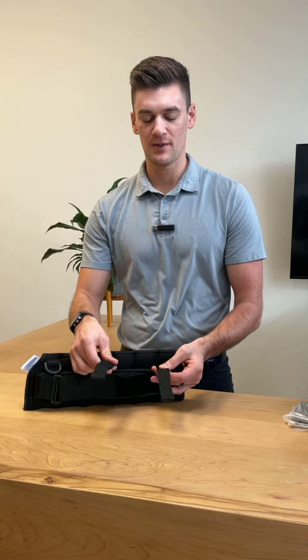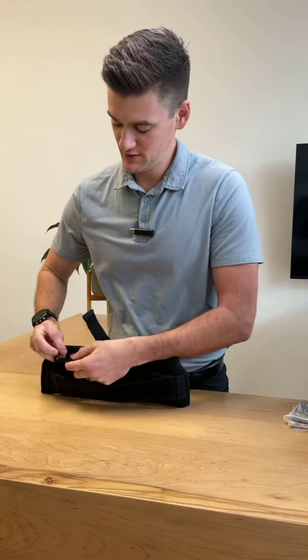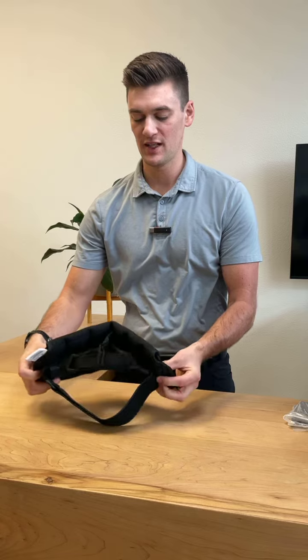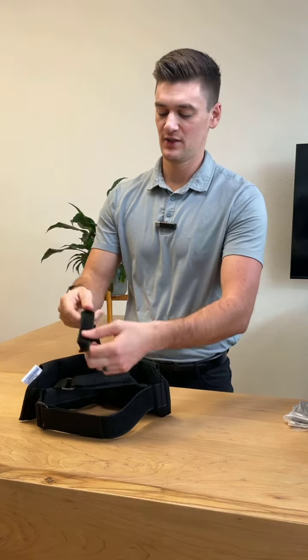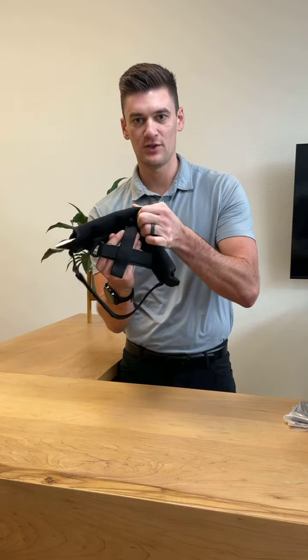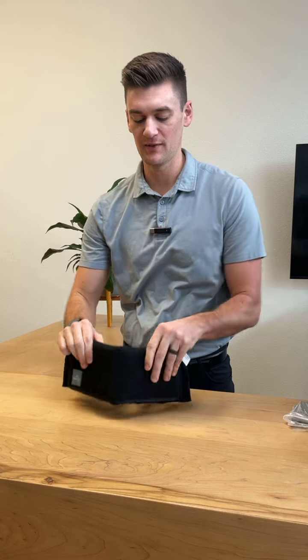The next step that I get the most questions on: we have these two velcro straps. The one on the side you want to undo, and you're going to bring it straight across to this plastic d-ring, then pull it through and back down onto itself. That helps create the top bridge so the head weight doesn't slip down. Next, you're going to take the cross member, slide it underneath, and then back onto itself. This creates a web so the head weight doesn't slip down, and you can set it at the appropriate height for yourself.